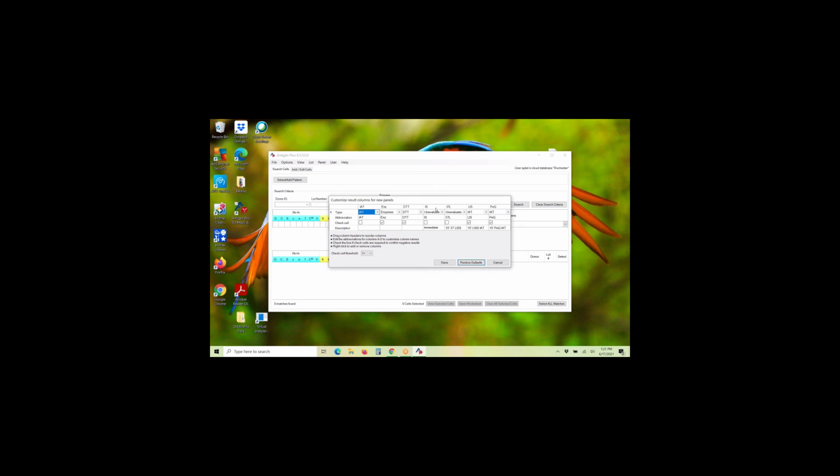For the immediate spin column, we went ahead and put it in as unevaluated, which is what you would want to do because at immediate spin and 37, you're going to be detecting primarily IgM antibodies, occasional IgGs at 37. I suppose you could detect some at immediate spin as well, but we don't want to do exclusion, rule anything out at those phases.